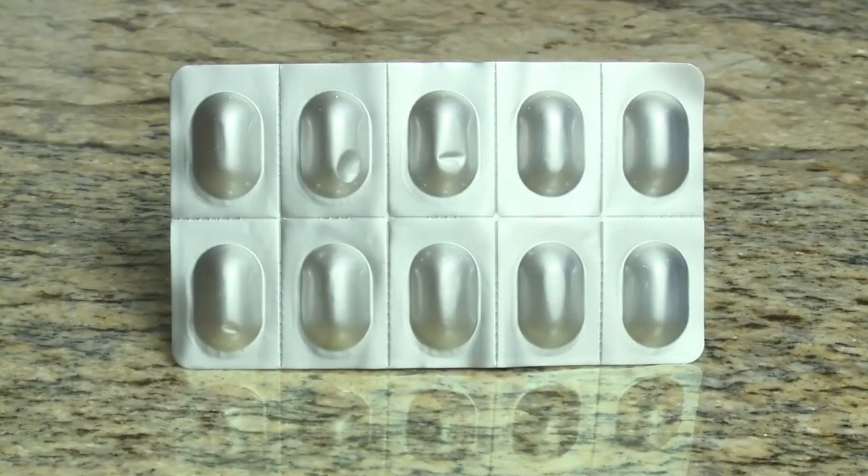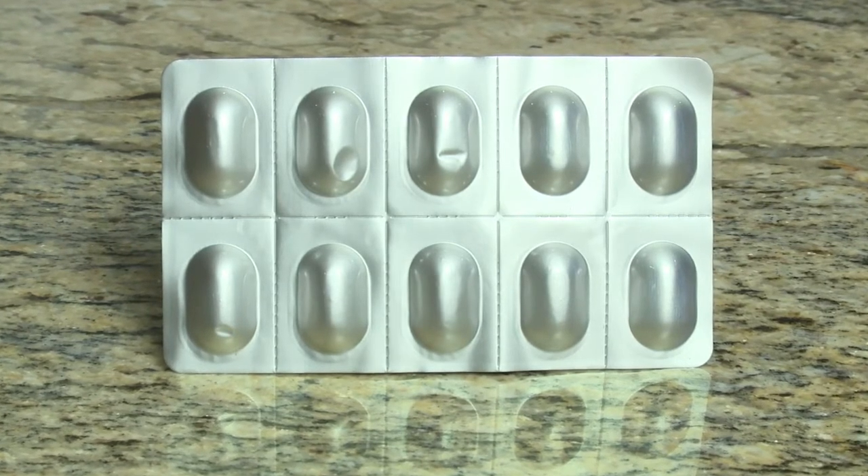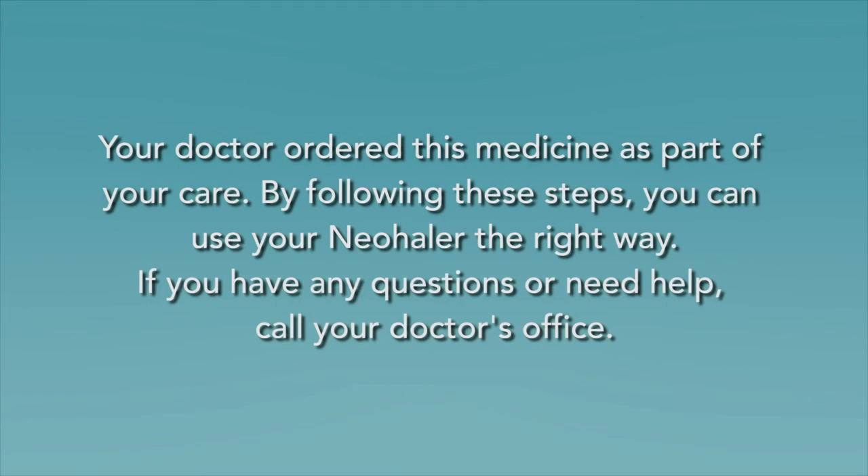Check your capsule blister pack after each treatment. This will help you make sure you have enough medicine for the next treatment. Your doctor ordered this medicine as part of your care. By following these steps, you can use your neohaler the right way. If you have questions or need help, call your doctor's office.